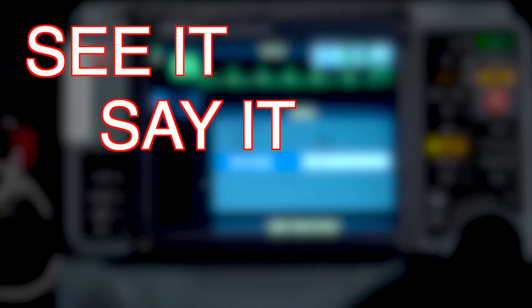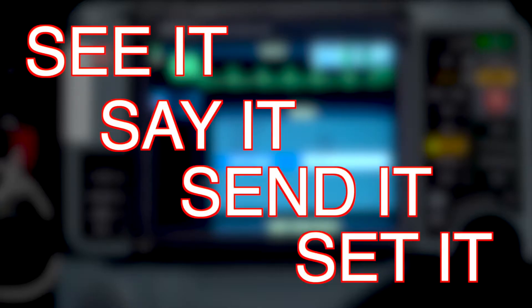See it, say it, send it, set it. In the next few minutes, we're going to focus on these four thoughts to help you provide excellent patient care.